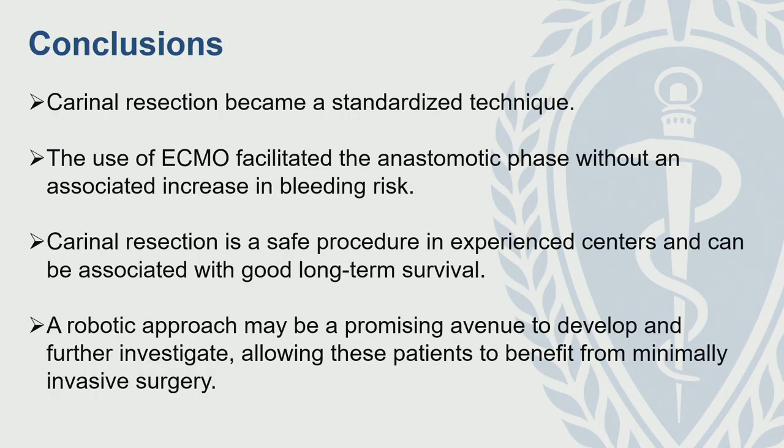In conclusion, carinal resection became a standardized technique. The use of ECMO facilitated the anastomotic phase without an associated increase in bleeding risk. Carinal resection is a safe procedure in experienced centers and can be associated with good long-term survival. And the robotic approach may be a promising avenue to develop and further investigate, maybe allowing these patients to benefit from minimally invasive surgery. Thank you.